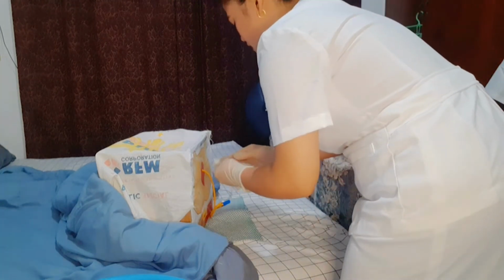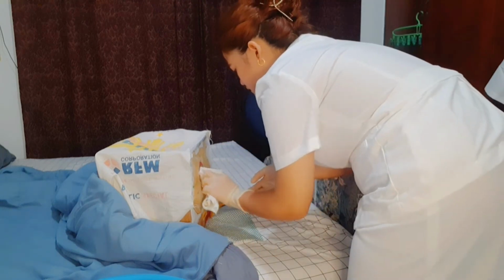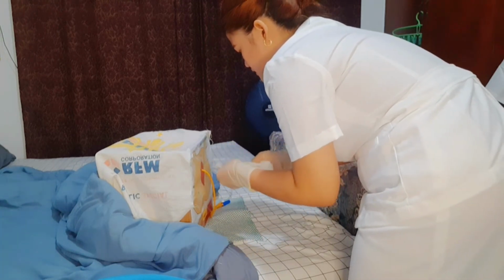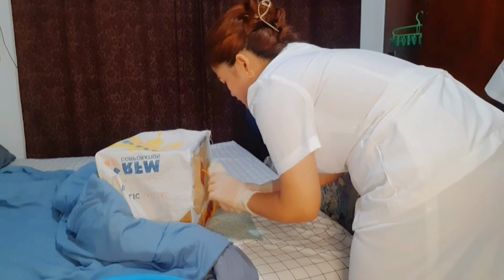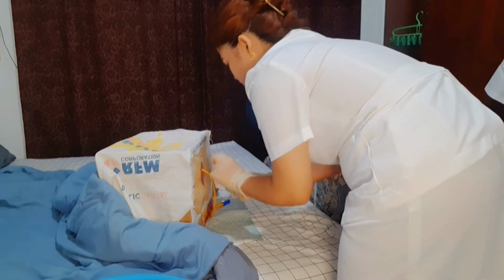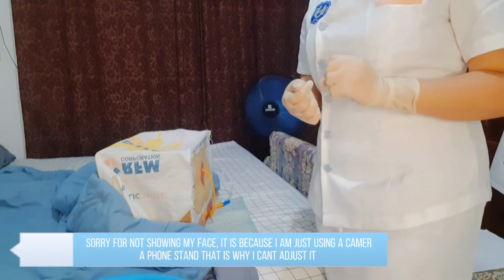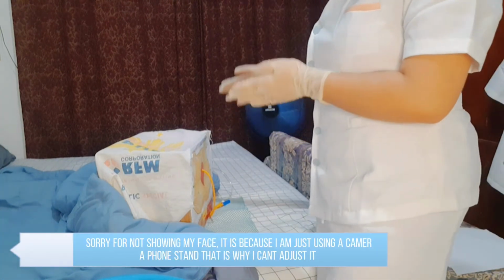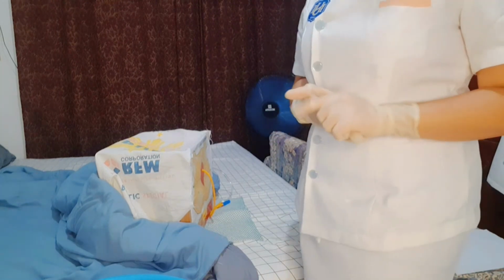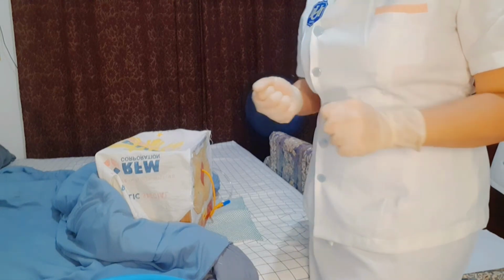So I will clean it using the first layer from the center, and then the second layer, okay, and the third, okay. So I will dispose of it. The rationale of that is cleaning from the most clean to the least. It decreases the risk of urinary tract infection, which is coded as UTI.